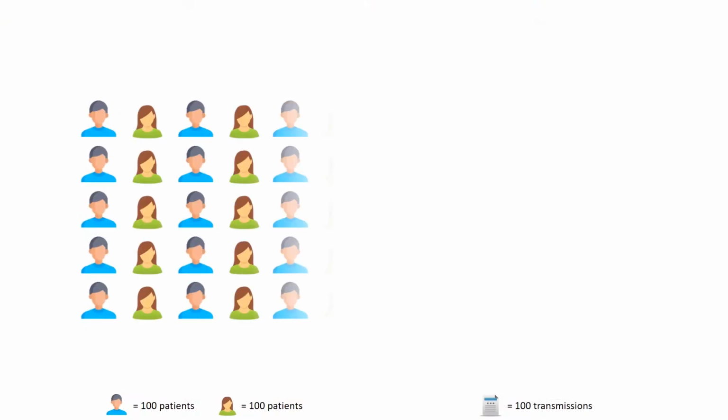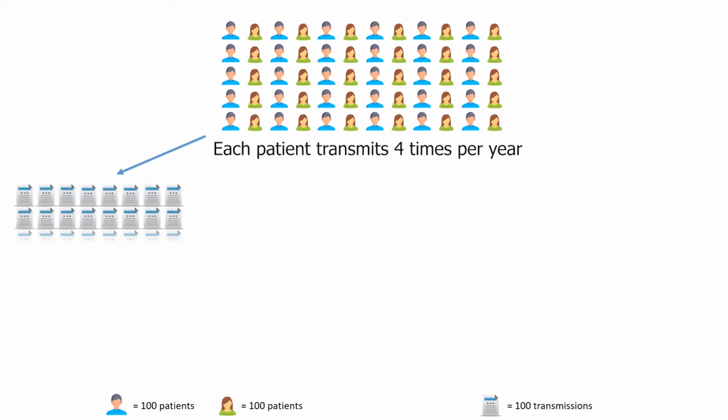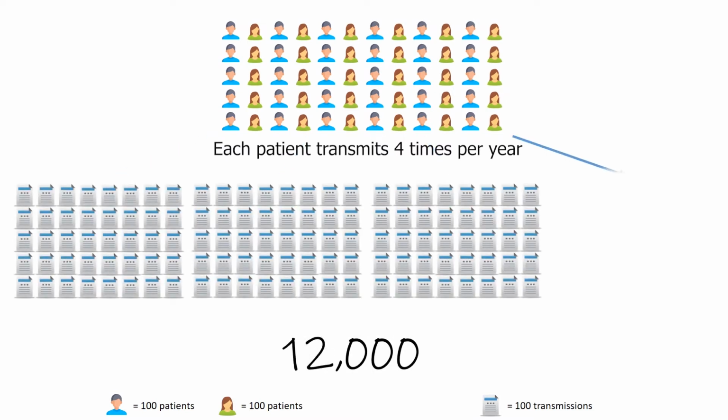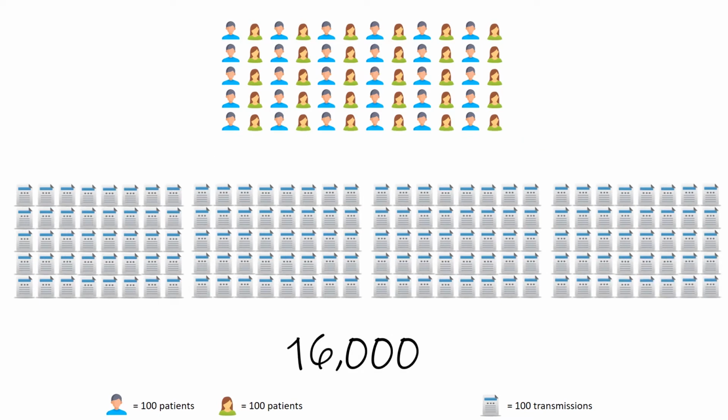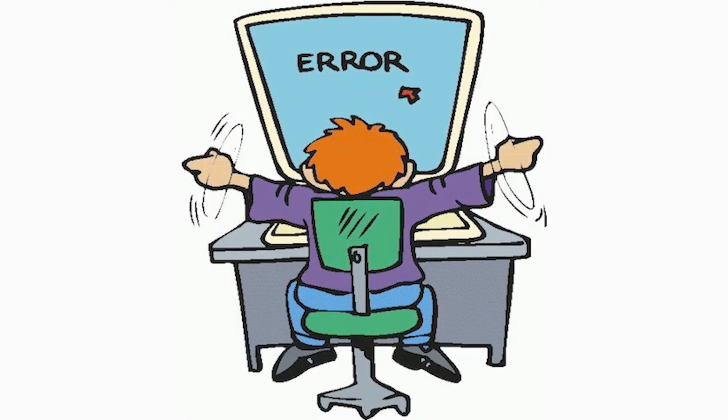The Frankel Cardiovascular Center follows almost 6,000 patients with cardiac pacemakers and defibrillators. Cardiac devices regularly send us transmissions which are reviewed to detect device abnormalities and respond to dangerous heart rhythms. Currently, our device clinic receives more than 16,000 such transmissions per year. However, our current process of reviewing home monitoring is extremely resource and labor intensive and is also vulnerable to human error.